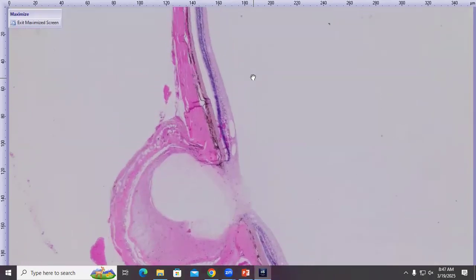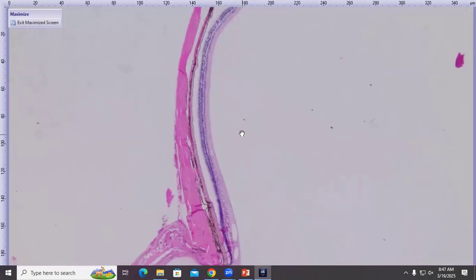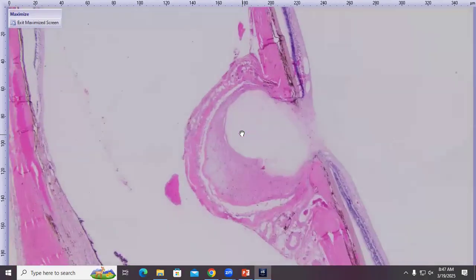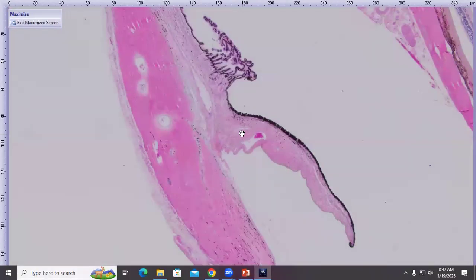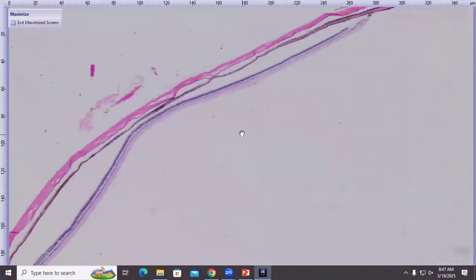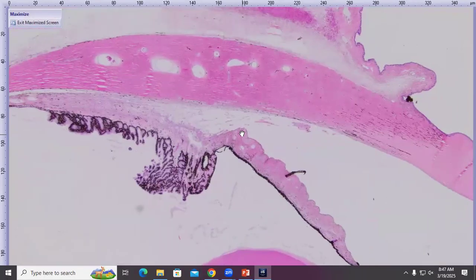You can see from low magnification that the retina does have its layers still, but we'll look closer because the ganglion cells are definitely lost. This is showing off how cats tend to maintain the basic architecture of their retina, even in chronic glaucoma, but the retinal ganglion cells are usually totally lost. That one is just artifactually a little bit narrow, I swear. We'll look at that closer, but also showing off on this side that, again, the angle looks pretty open and well-formed. So what's causing our glaucoma is the question.